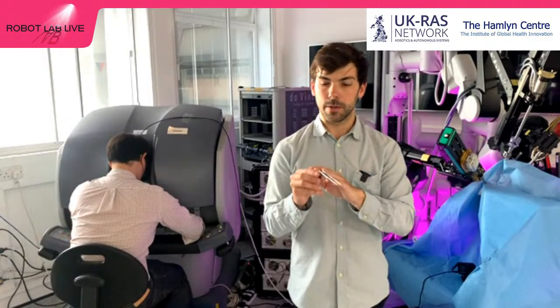So if you think, for instance, when you're playing a video game, right? Or even when you are using your smartphone and you are touching the screen, if you have not deactivated it, you feel a small vibration that tells you that you are going through a new folder or that you are doing a new task, right? So following a similar concept, we can embed the necessary hardware in these forceps. And so when we perform the task, if we do something that is dangerous for the patient, the tool can vibrate, for instance, or send a small alert to the surgeon so he knows that he has to stop. And these are small things, but they are very important and improve current surgical procedures by a lot.